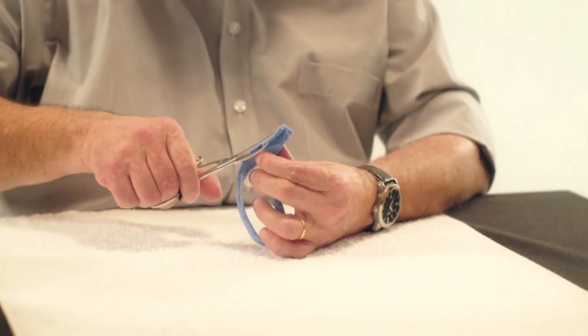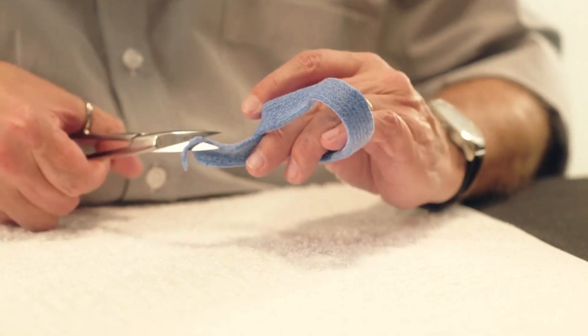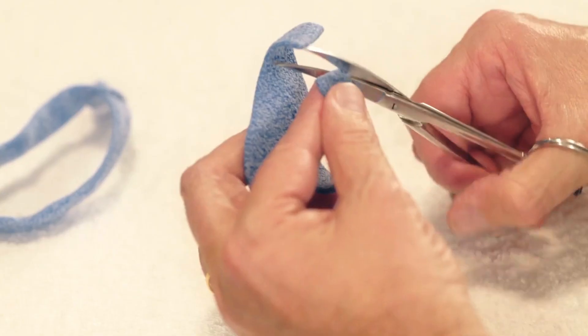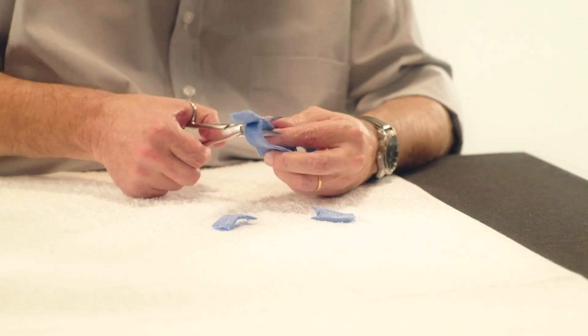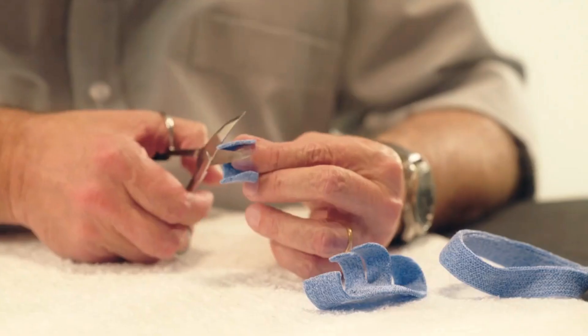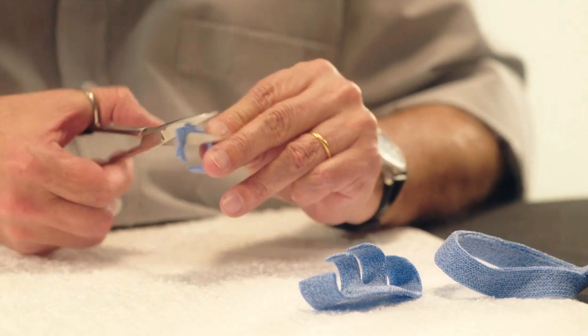Before assembly, cut away any excess material and round all corners. Take the second component from Step 2 and cut the finger loops so as to keep only the ulnar and dorsal side of the loops. Round all of the corners and trim the edges of the third component destined for the index finger.